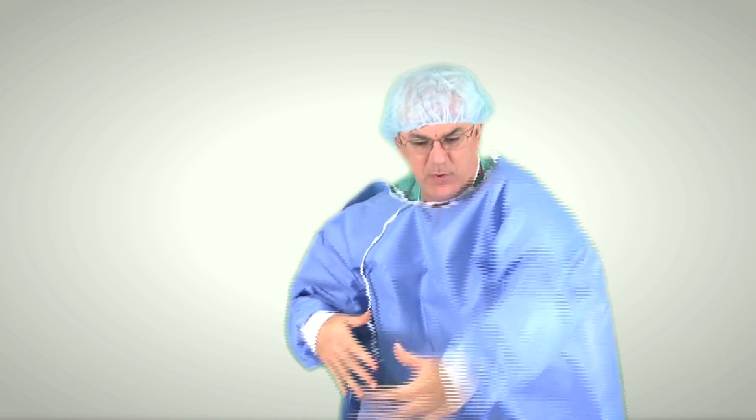We initially learned to glove up without using gowns and that's relatively easy. You go like this and then you go like this, and we're all familiar with that. But when we gown with surgical gowns on and try to put the gloves on, most of the time our experience from medical school is we walk in the room with our hands washed, they put the gown on us, and they hold the gloves out for us so we just do that. We don't have any trouble gowning and gloving ourselves because someone helps us.